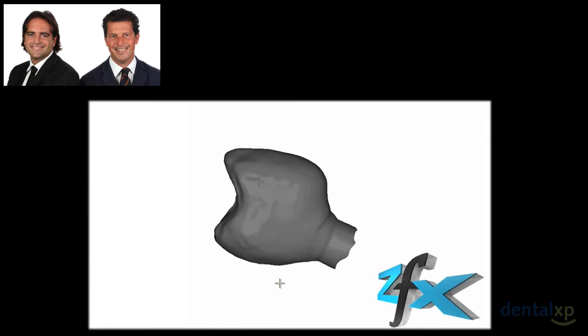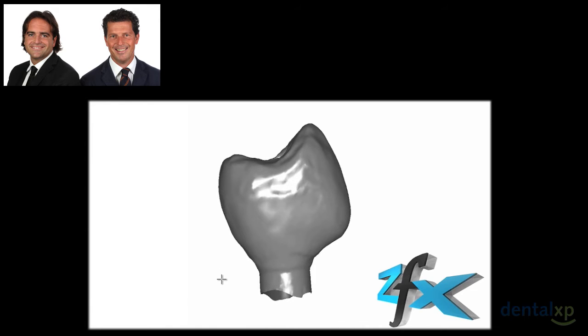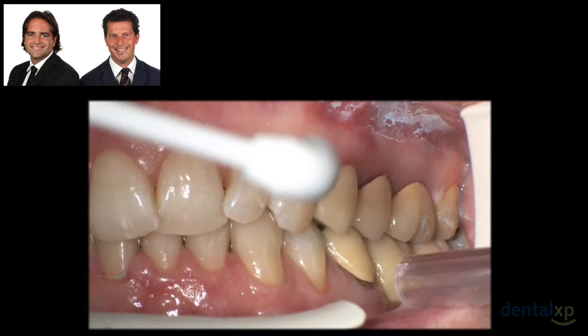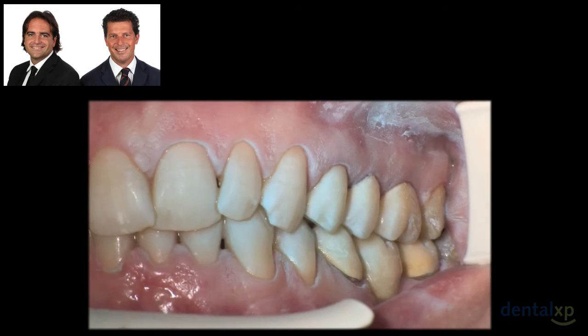And you can see here, this is why it's so important to spend time while you are shaping and smoothing your temp chair side, because here you're gonna get all the benefits of that day. Of course, it's important to finish the scan, taking the bite registration. It's very easy.